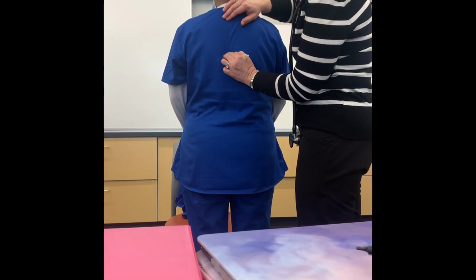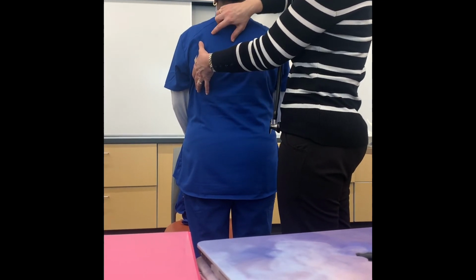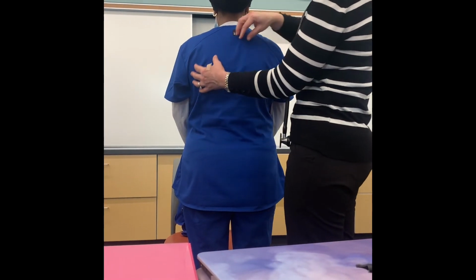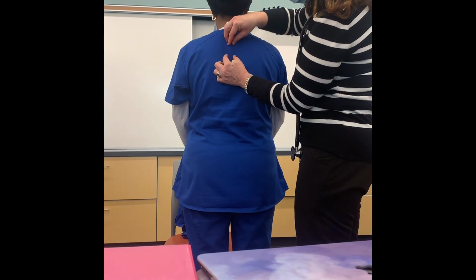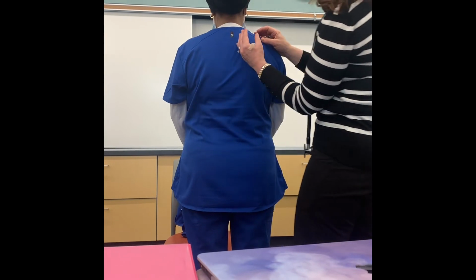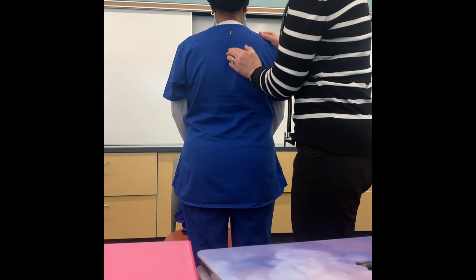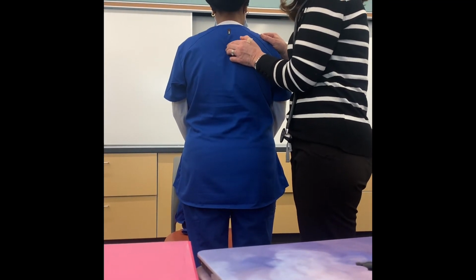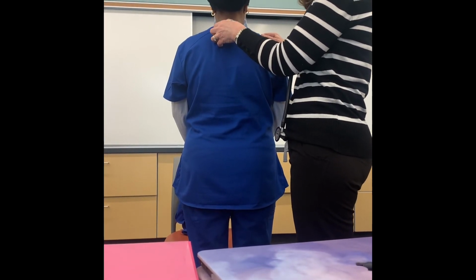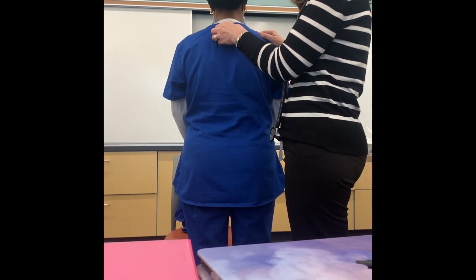What I'm thinking is a letter J. It goes down, down, down, and then goes this way. And remember, my lung is smaller here because I have other structures and because the chest is wider here. So I do a letter J, and then down here, and the letter J in the mirror goes this way. If I listen here, that's her spine. I'm not going to hear lung sounds. We have the spinal column, ligaments and tendons, and bones, so that goes about there.